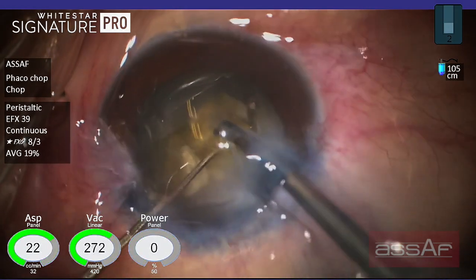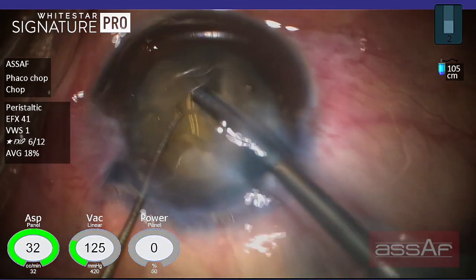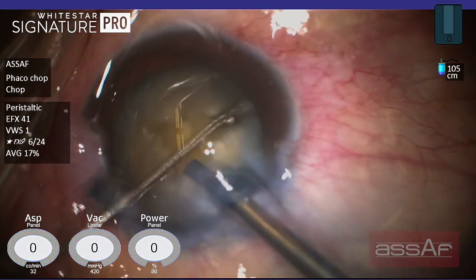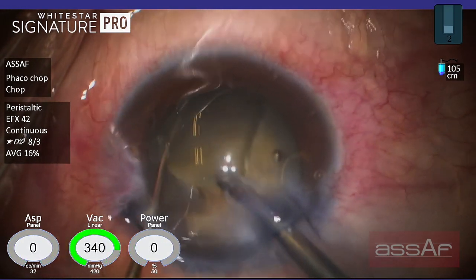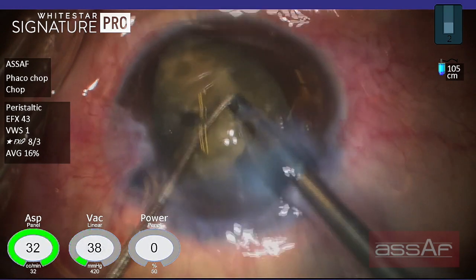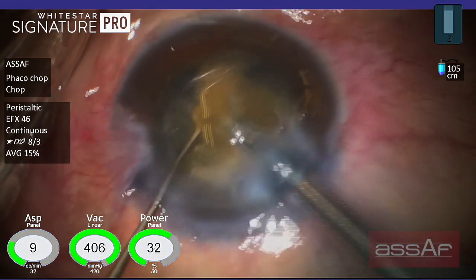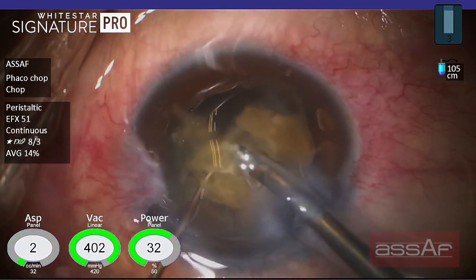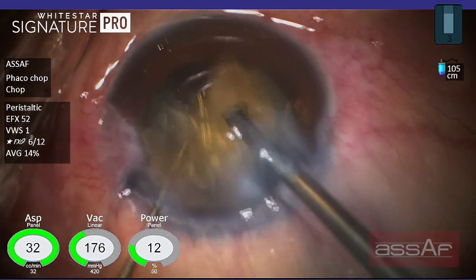Starting with the smaller quadrant and the least attached one. Using the second instrument to divide those cortical fibers connecting this quadrant to the rest of the cataract. Now rotating the nucleus counterclockwise — utilizing the space available to get underneath the second quadrant, trying to elevate this posterior isthmus and mechanically disrupt these cortical fibers connecting the quadrant with the lens, then emulsifying this freely mobile quadrant within the lens capsule or in the supracapsular plane.